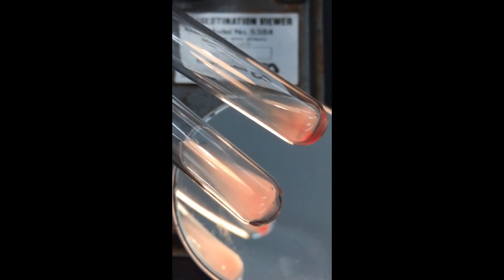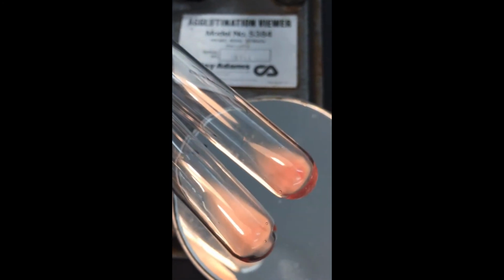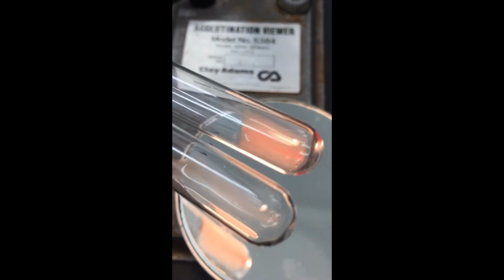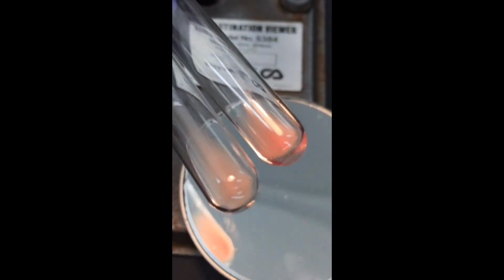So I know you know what we need to do now. Everything that was negative is going to be read microscopically. All right, so here we go. Bottom is 19, top is 20. This is sample C and this is cell 1, and I did this on purpose just in case you were having trouble when I'm reading it from the tube.